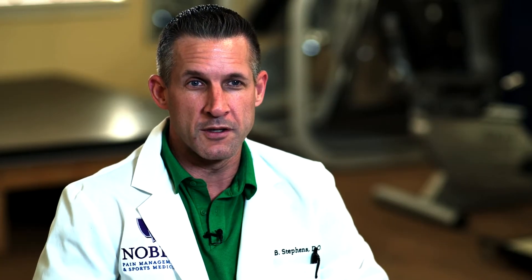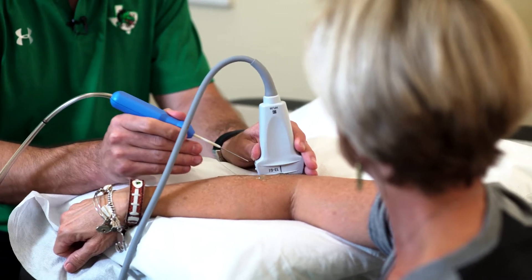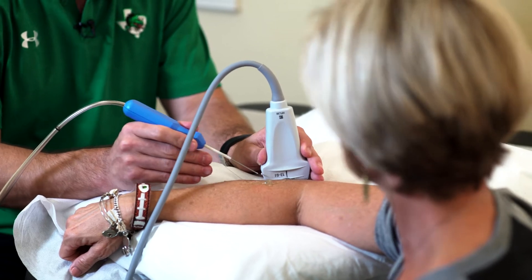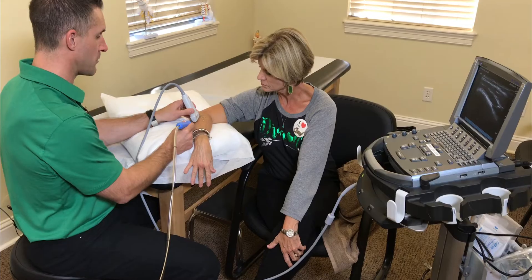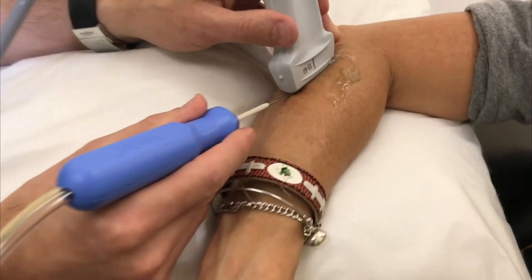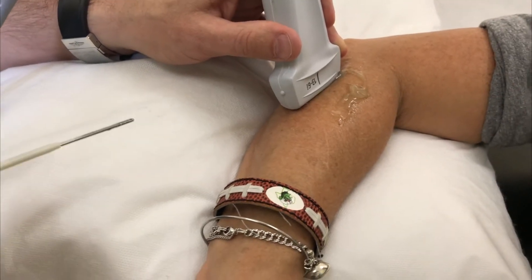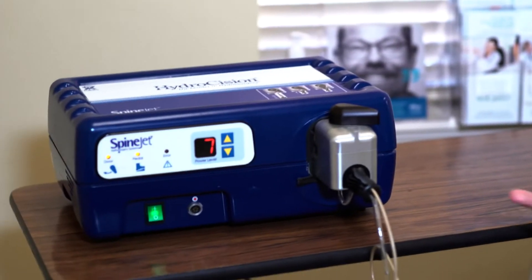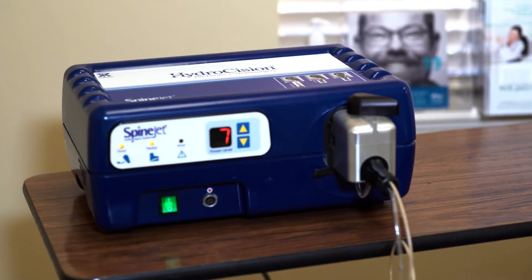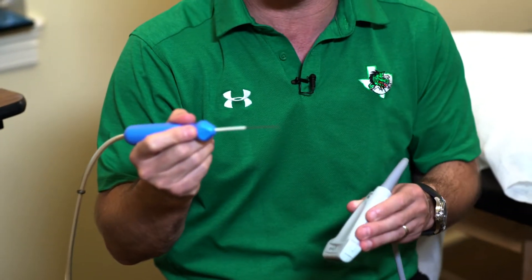I'm honored to talk about the story of a good friend and patient of mine, Sally Wasson. What we're really doing with this procedure is going into the tendon that's damaged and using a supersonic wave of water — we're actually using water as our cutting device. It microtraumatizes the tendon, which allows blood flow to increase to the tendon and allows healing.